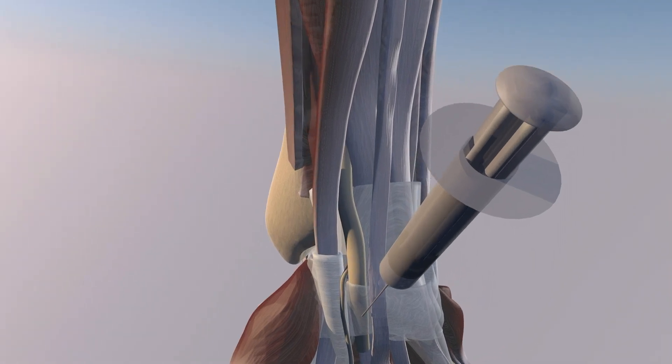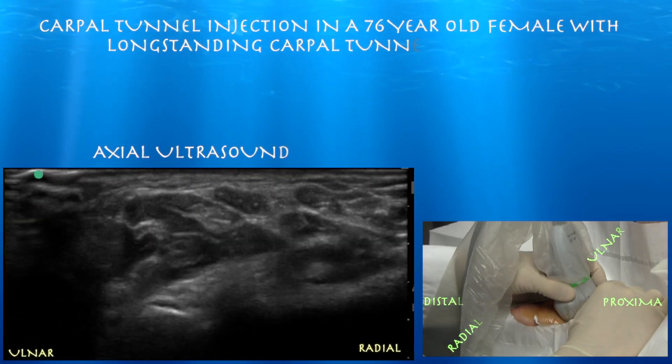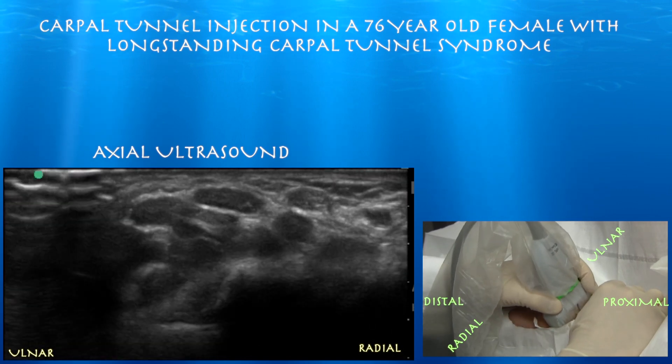Here's a different approach where we're going between the palmaris longus tendon and the flexor carpi radialis tendon. The needle is essentially directly above the median nerve, and it is also close to the palmar cutaneous branch of the median nerve, which you can see highlighted here. The left side of the screen is ulnar, and the right is radial.